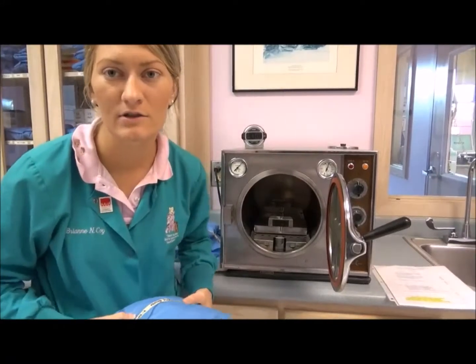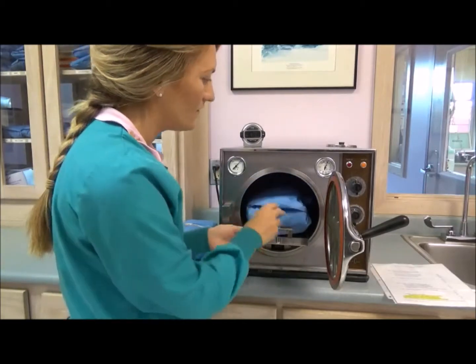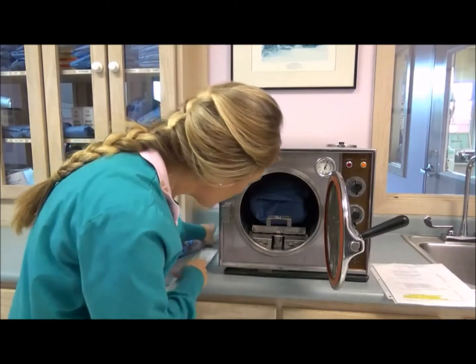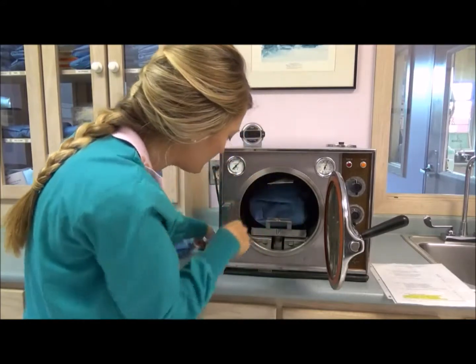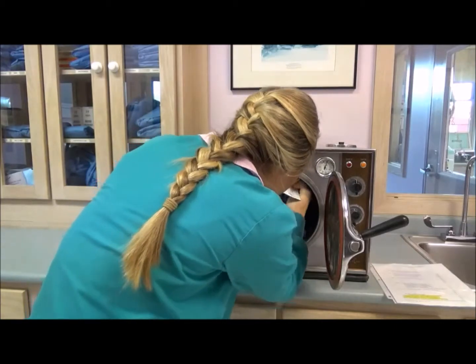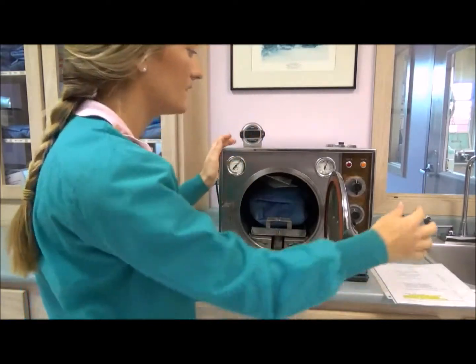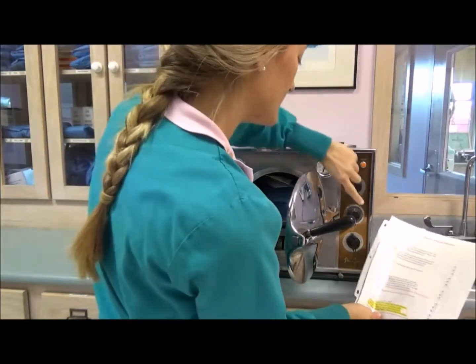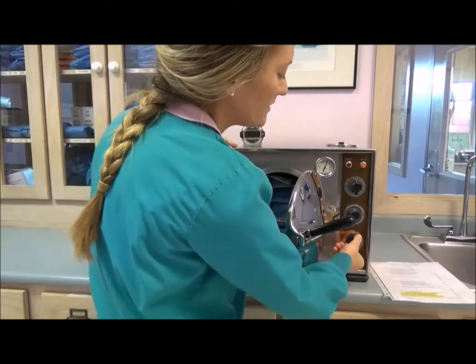Okay, now I'm ready to load the chamber. So I'm just going to load them here on the bottom tray. And I'll make sure that I'm careful that I don't overpack the autoclave. So I don't want anything really touching the sides, the inner sides of the chamber. That looks good. So then next, I'll just follow my template here. So I'm going to fill the machine here with the distilled water. So I just turn it to fill.